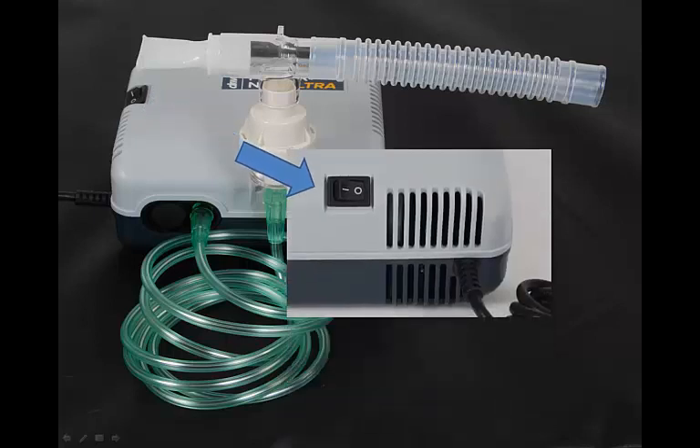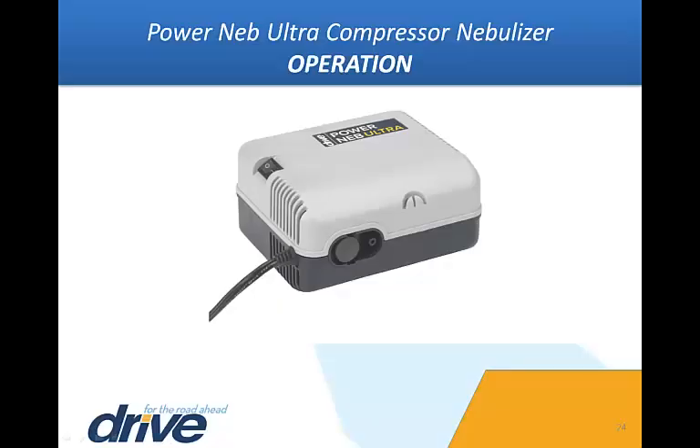Turn on the power nebulizer ultra by pressing the power switch to the I position. The machine will make a humming sound and will quickly produce a medicated mist from the nebulizer assembly. If treatment needs to be interrupted for any reason, turn the unit off by simply turning the power switch to the O position. To resume treatment, turn the unit on by turning the power switch to the I position.